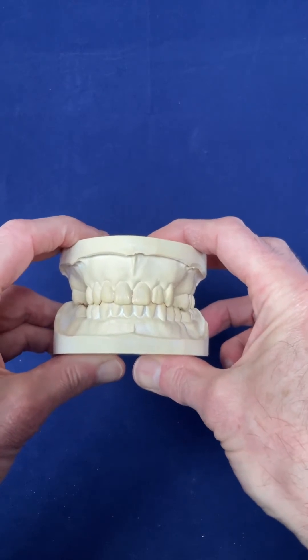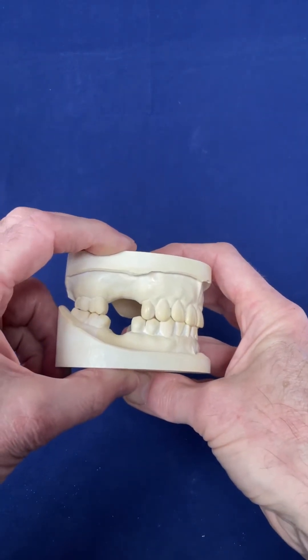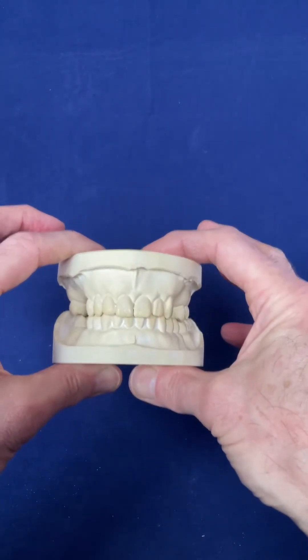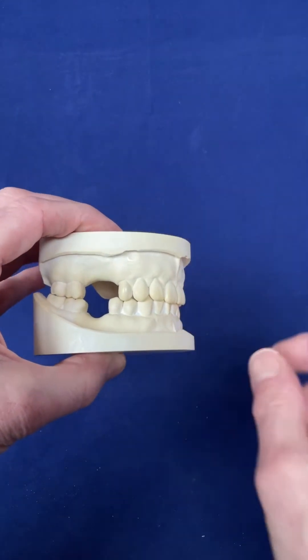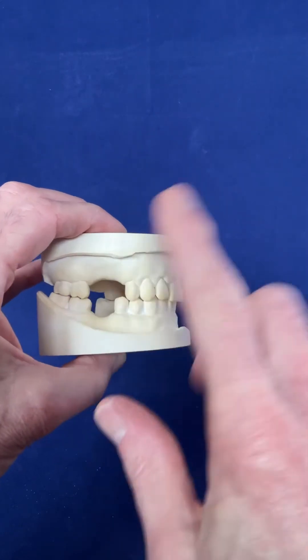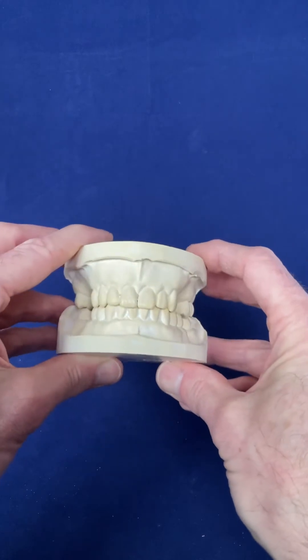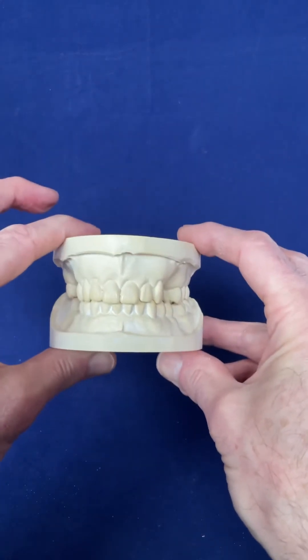You only need a fixed point where the teeth intercuspate that is reproducible to record centric occlusion for a patient like this. If you're restoring to centric occlusion, you simply record a bite registration between the upper and lower arches. The vertical relationship is fixed, the patient can't over-close, and you can see these premolars and molars intercuspate. Straightforward case — centric occlusion, no problem.